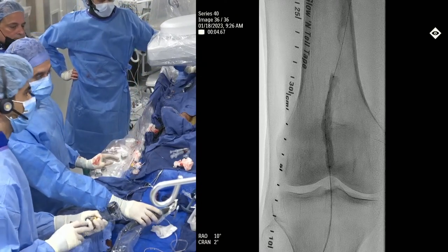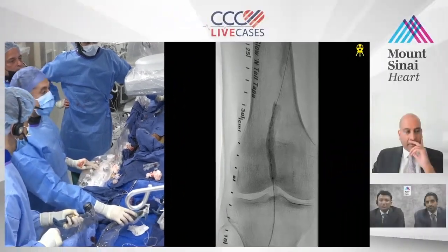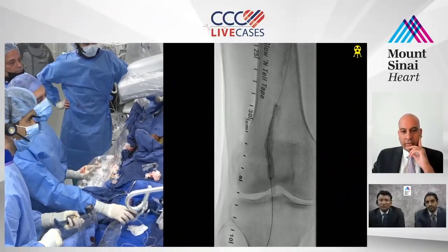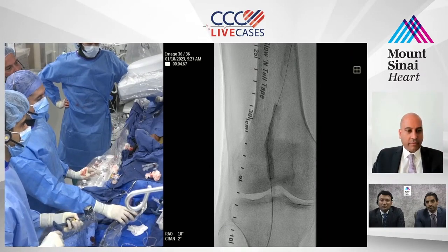This angle, the alignment looks so much better, like Karthik and Raman. Guys, really just incredible. You've got this eccentric calcification, even though we're subintimal, probably. It's tough. One more, of course.